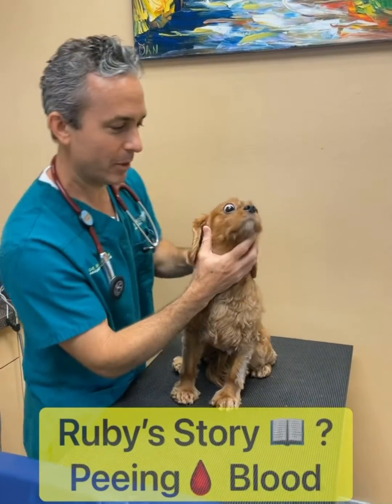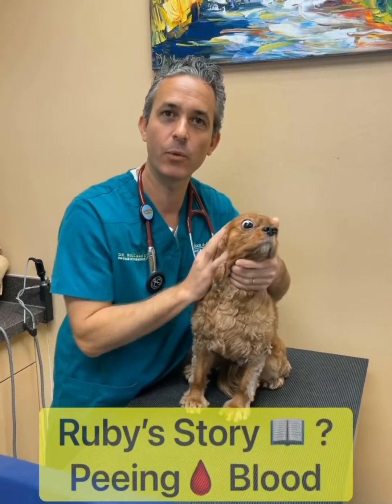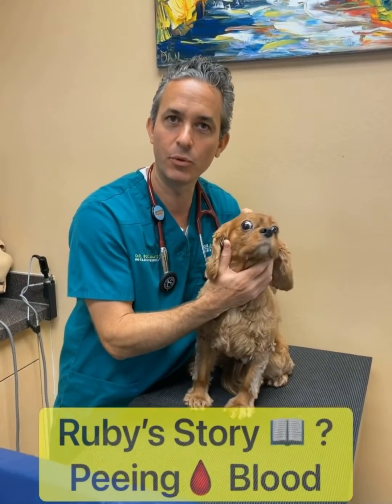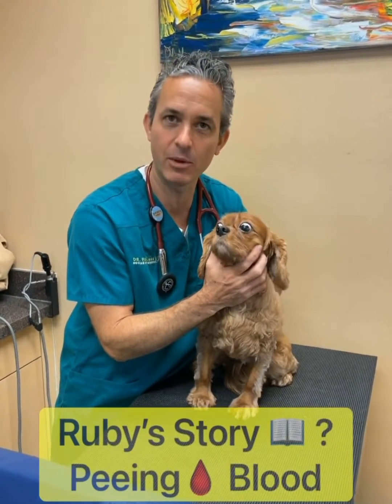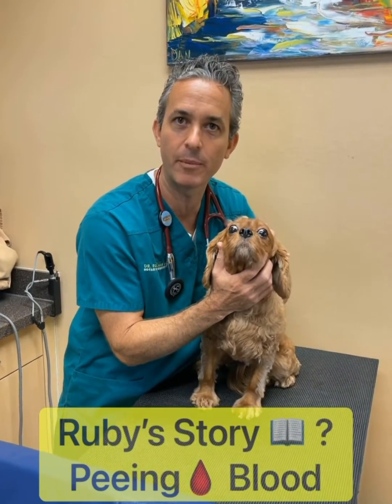Hi everyone, I'm here with Miss Ruby. Ruby came in to us because she's had blood in her urine, and we're going to use a new ultrasound device today to show you how we get a sample of urine directly from her bladder.